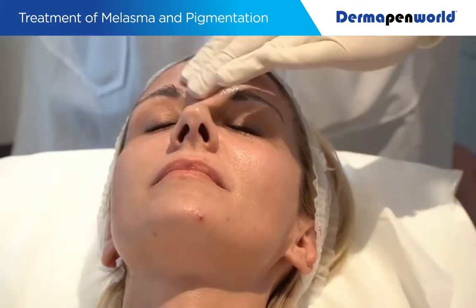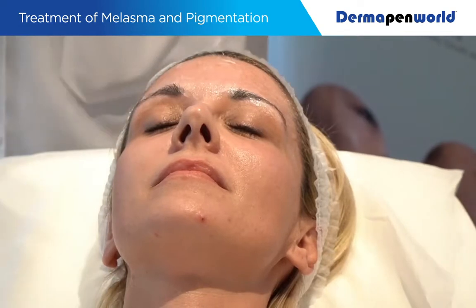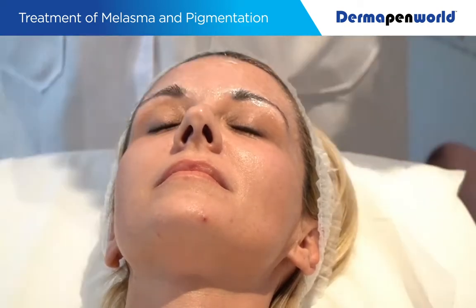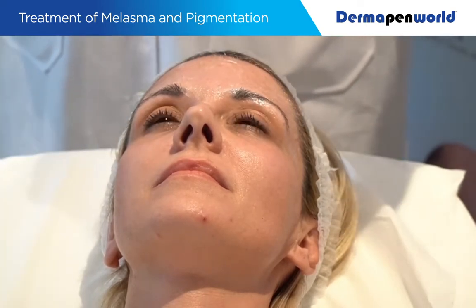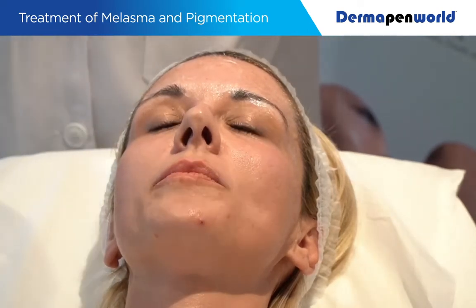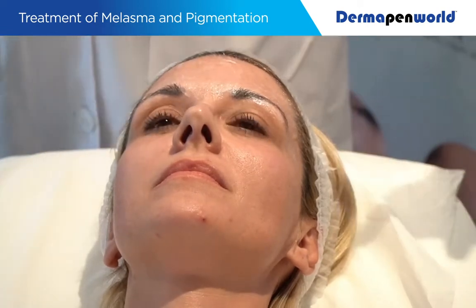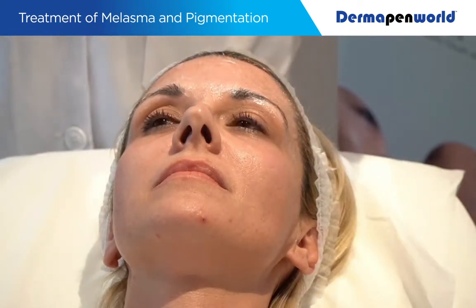Whilst I don't like talking mathematical figures, in my mind I know that most patients bleed on the forehead at around about 0.5, 0.6. I don't want to go that deep. I know that most patients don't bleed at 0.2, 0.3. So for me, I think it's going to be a 0.4. But we're going to watch as we perform that procedure to determine whether you're right or wrong. Patients will completely surprise you. I've had patients bleed at 0.2 on their cheeks. I've had patients not bleed on their forehead at 2 millimeters.